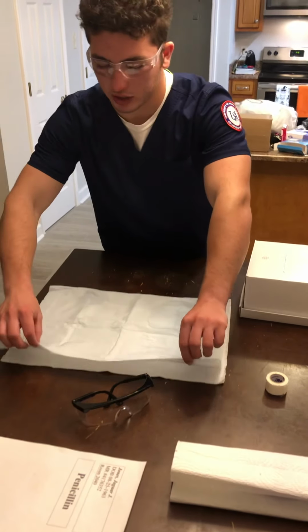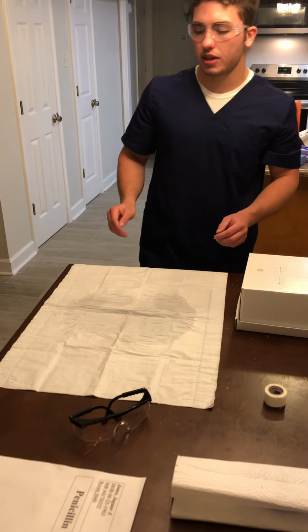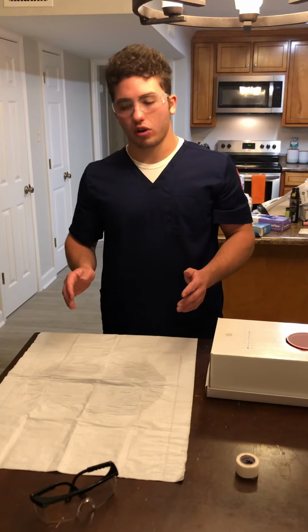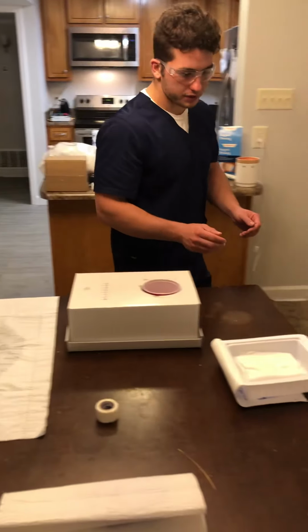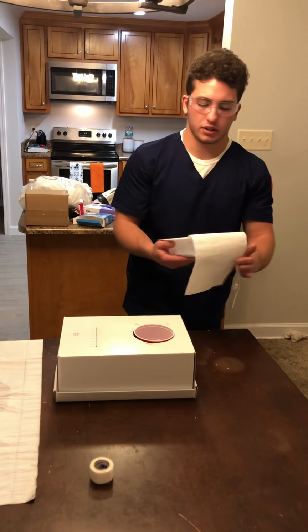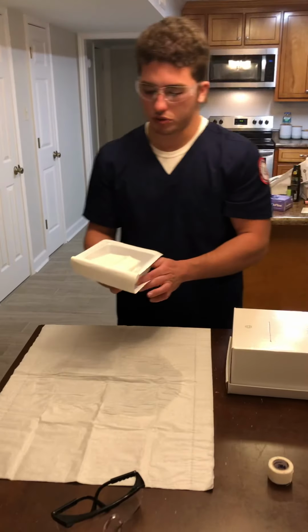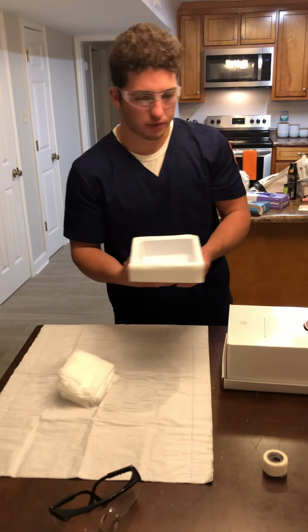Now it's important to note that any part of the sterile field that's hanging off the table is now considered contaminated, along with a 1-inch border all the way around the sterile field. I'm now going to take my sterile contents and dump them onto the sterile field in the middle.